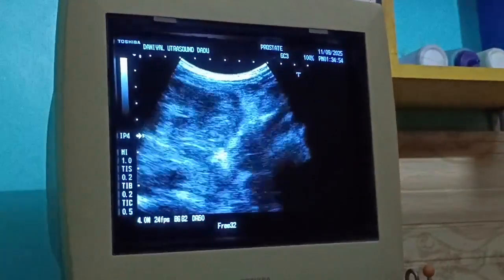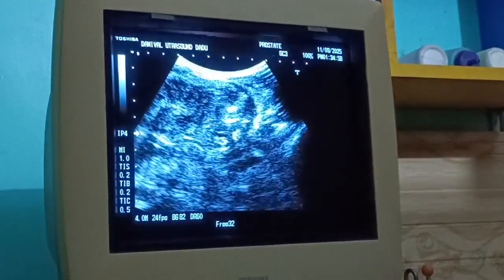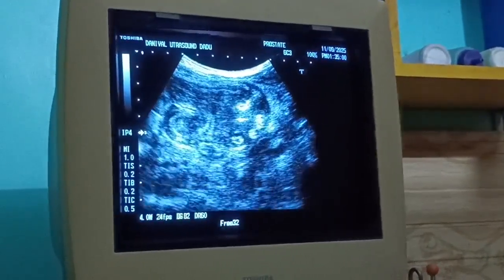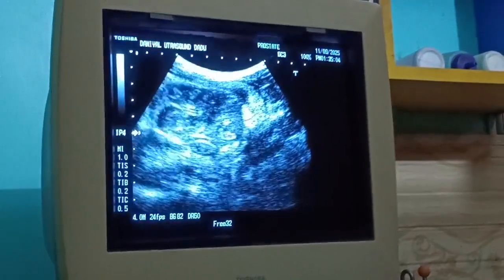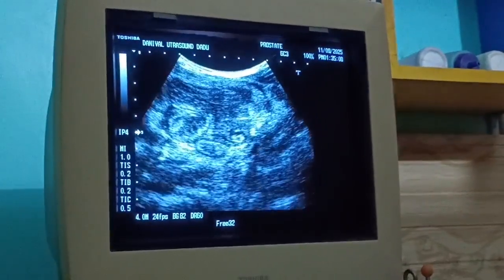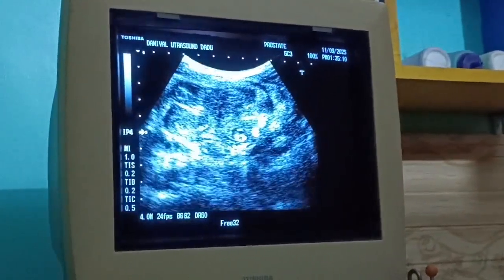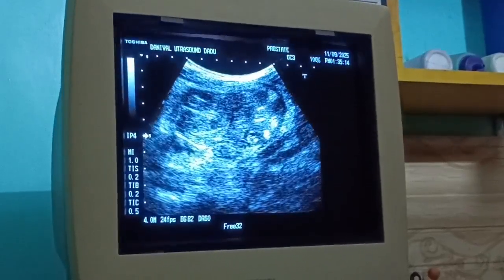So this was a really complicated case showing two pathologies at the same time. However, there is no peritoneal fluid. Here is the appendix as well as this extended process, showing adherent guts and thick wall guts. That's that.